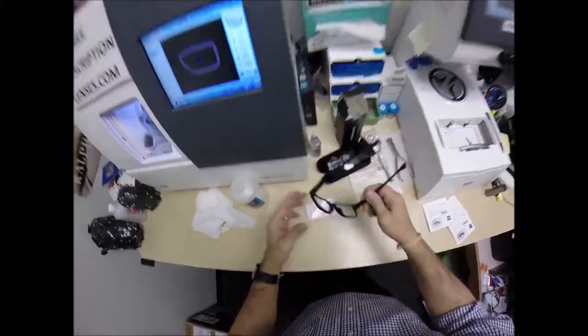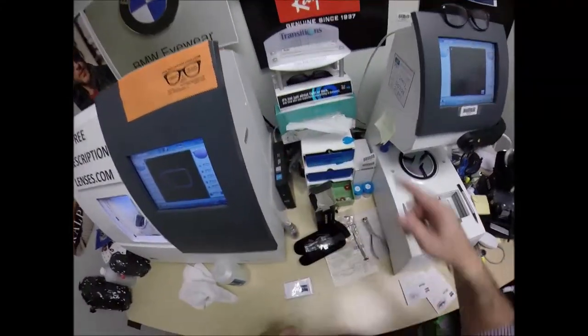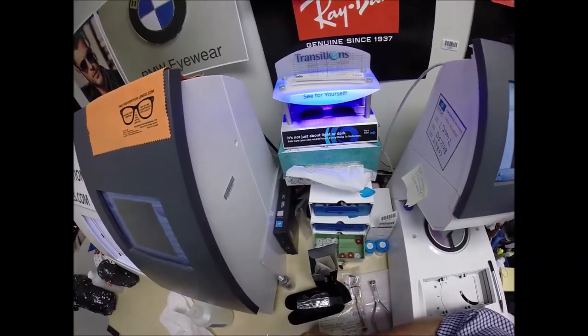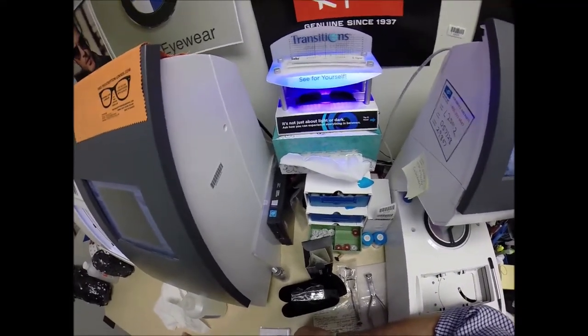I'm going to expose them to a strong burst of ultraviolet light. I wish I had a comparison — I need to get an Essilor lens and compare it against the Zeiss. It takes about 30 to 45 seconds for transition lenses to darken, and it takes a little bit longer to turn back to clear — about 45 seconds to a minute to a minute 15.